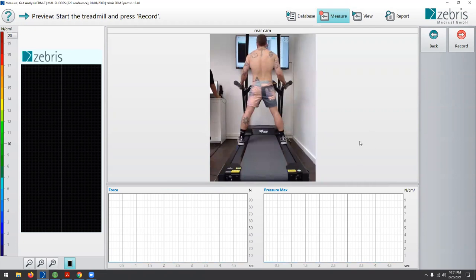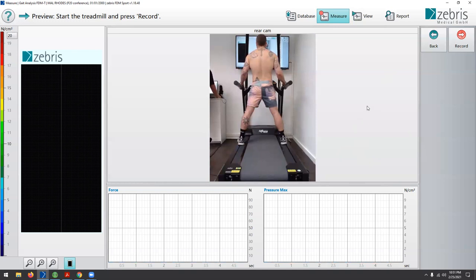Malcolm has a history of left knee pain that's plagued him for some years. He's a fit guy who runs recreationally around twice a week, covering four to five kilometres at around five-thirty to five-minute pace. His knee pain is described as anterior knee pain, most likely patellofemoral in origin — runner's knee. We're going to see if we can find anything and show how quickly we can grab data from this treadmill and use it to influence clinical treatment and gait retraining.